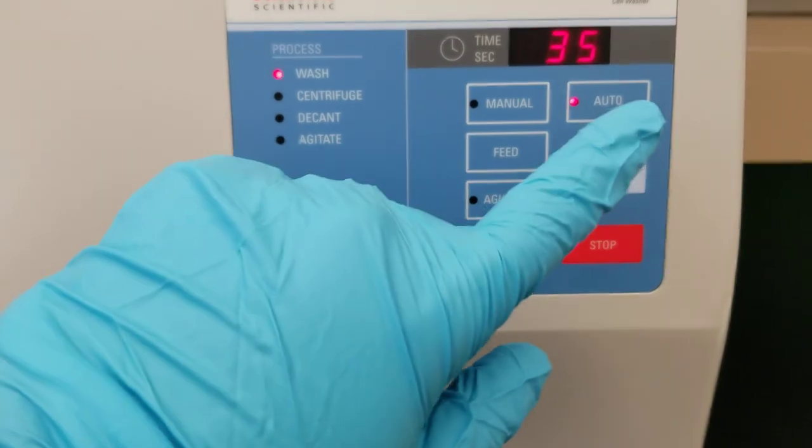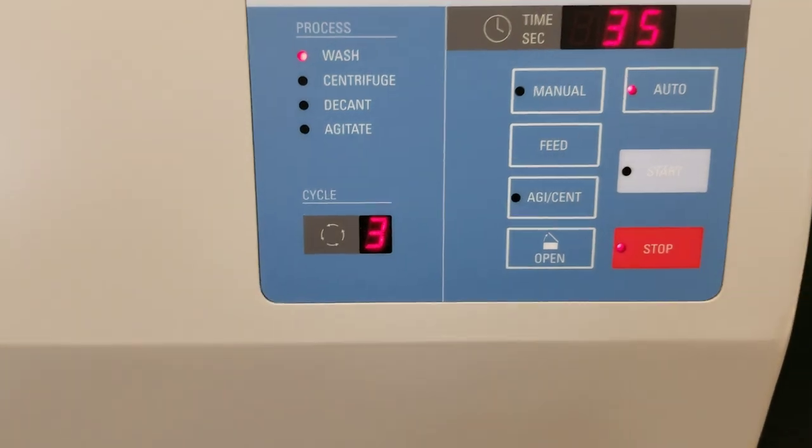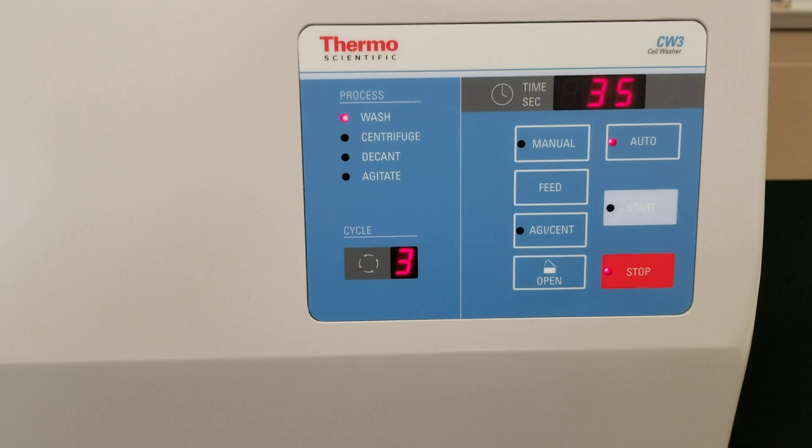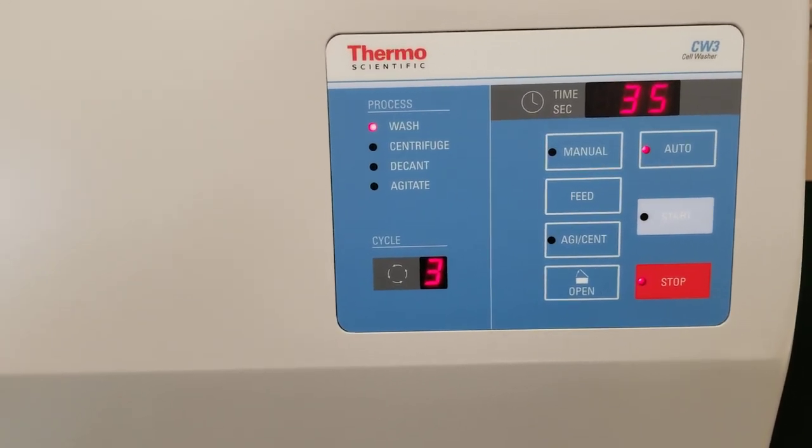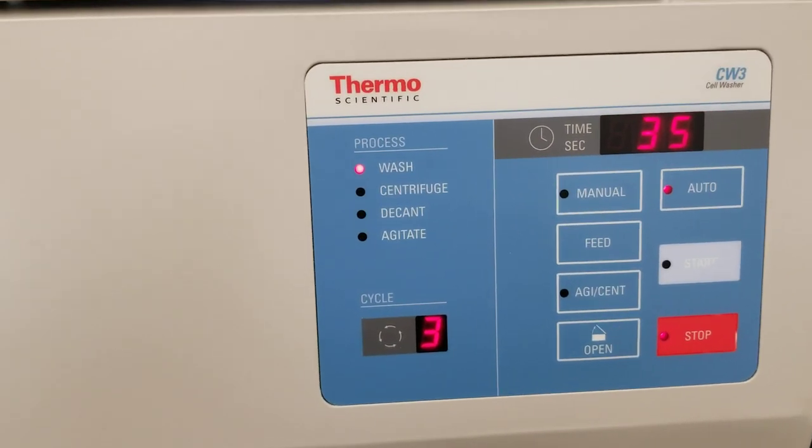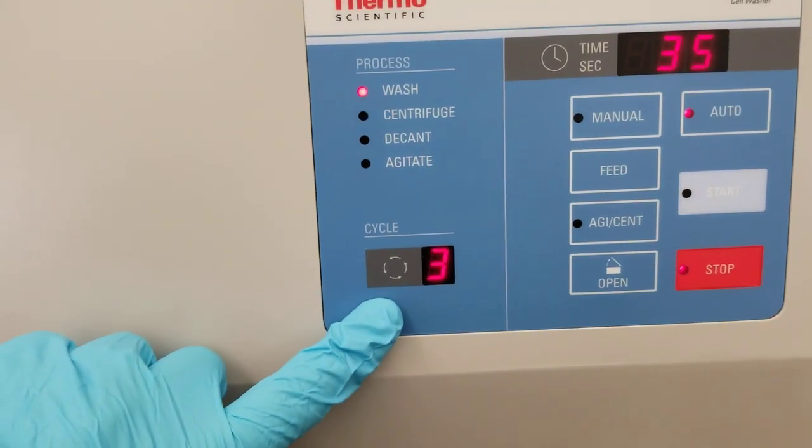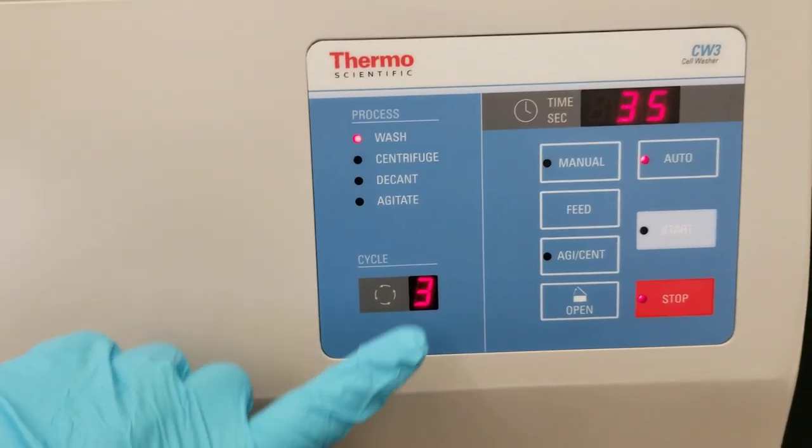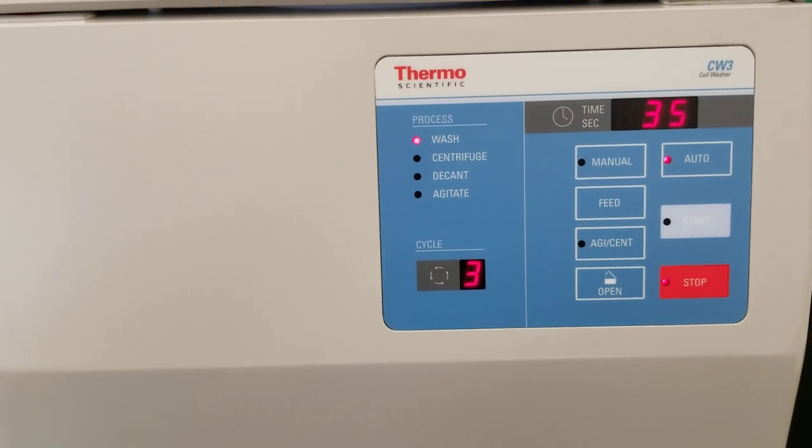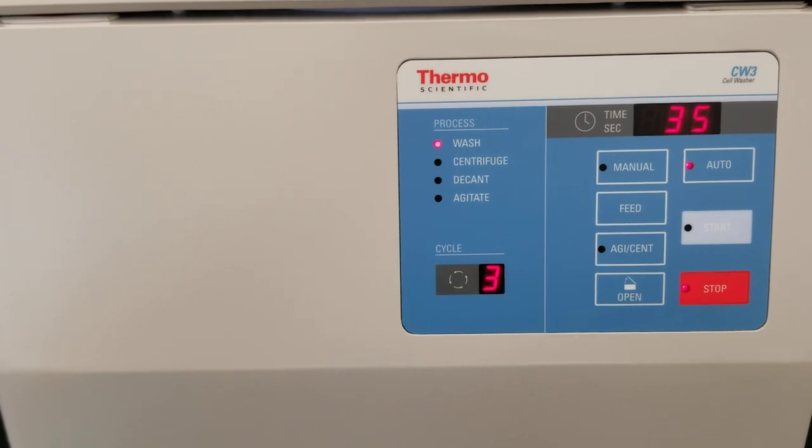This is set on auto. You can put it on manual mode or agitation, centrifuge mode. But we're going to keep it on auto. That means that it's going to do the whole process from start to finish without needing to change anything. Each part of this mode, each step is going to take roughly 35 seconds. And we have three cycles that we're going to run. So one cycle is about 35 seconds. So the most that this takes is up to three minutes, three to five minutes, depending on what it is that you're doing and how many cycles you do.